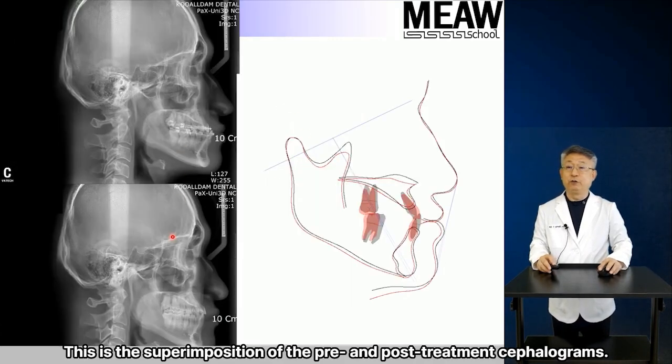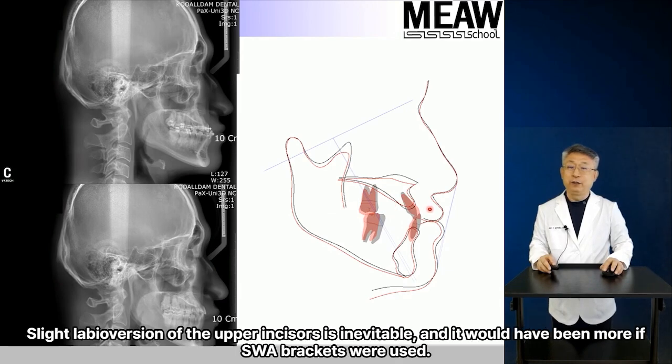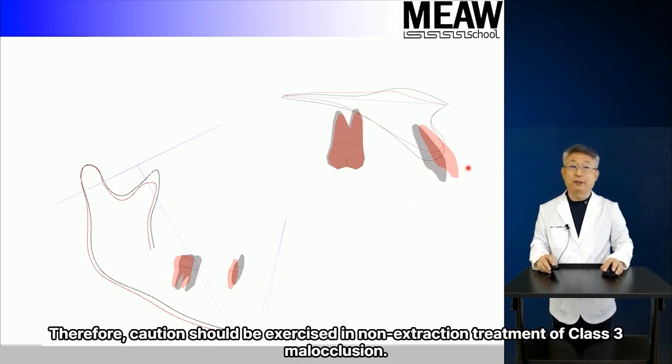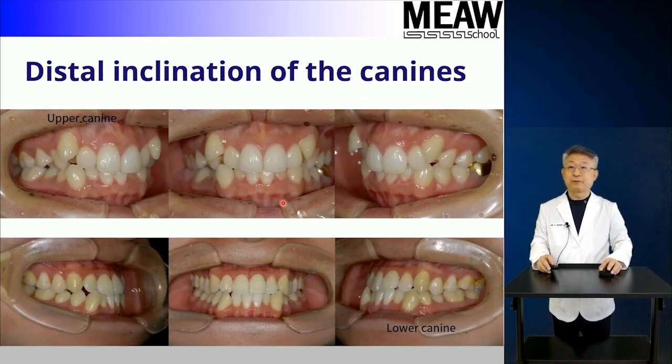This is the superimposition of the pre- and post-treatment cephalograms. The entire lower teeth moved posteriorly, and the entire upper teeth moved anteriorly. Slight labioversion of the upper incisors is inevitable, and it would have been more if SWA brackets were used. Therefore, caution should be exercised in non-extraction treatment of Class 3 malocclusion.